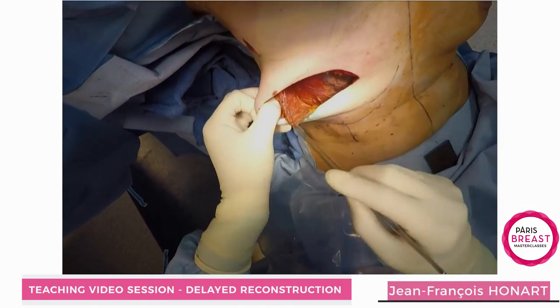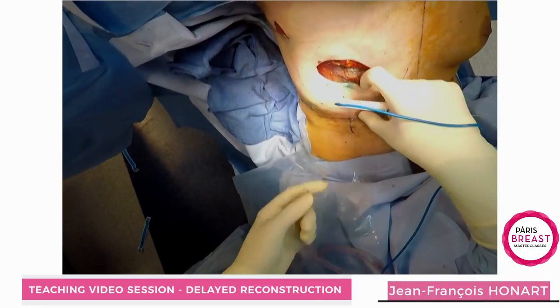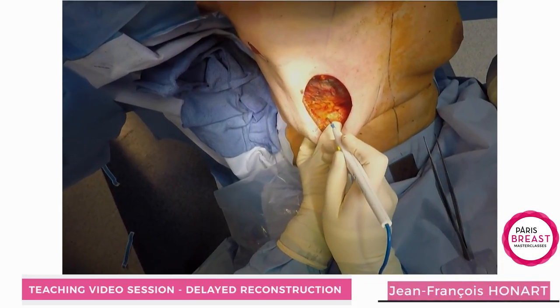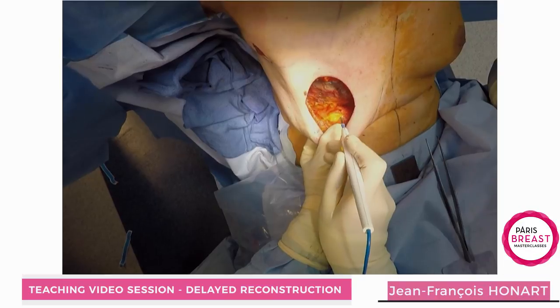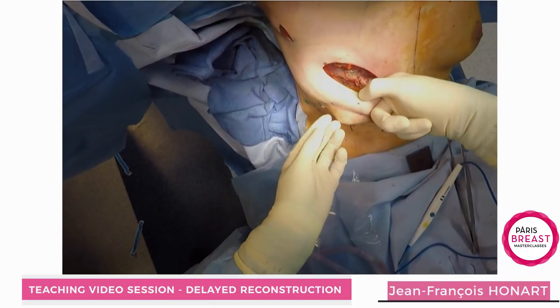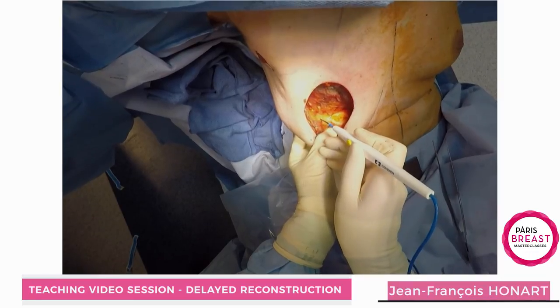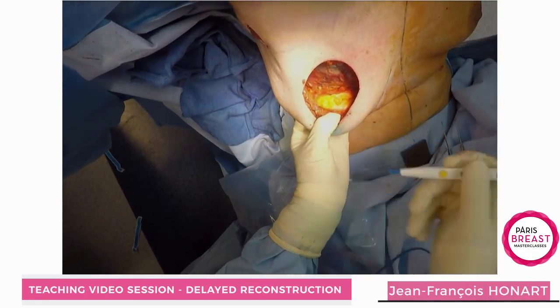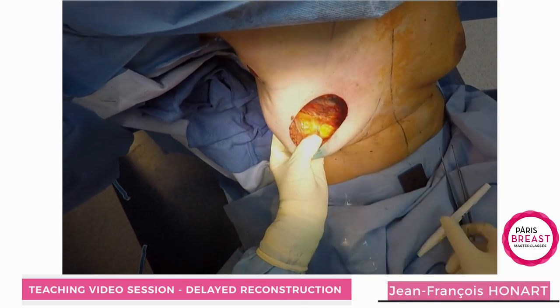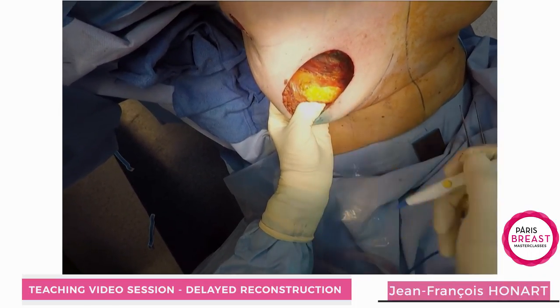This is the fascia of the serratus. You can see that you have enough laxity. We will cut the superficial fascia to recreate the new inframammary fold. This is the same technique of the hammock.